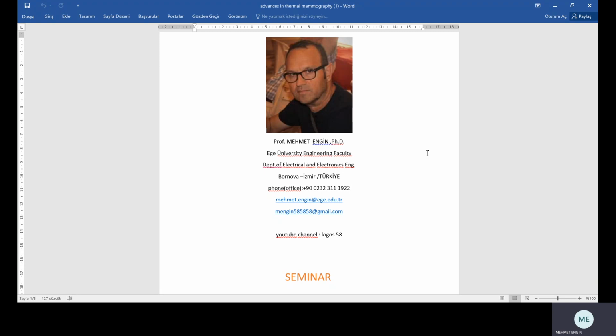In addition, it has the following disadvantages. The first one, low sensitivity towards younger women. The second one, a risk of radiation. Third, fear and pain for some patients. And last, patient privacy. Thermography overcomes the above issues and enables more people to go for screening. It can work on women of all age groups. It is a non-contact, non-invasive modality with a passive infrared instrument which doesn't involve any radiation. Hence, it is a safe screening method.